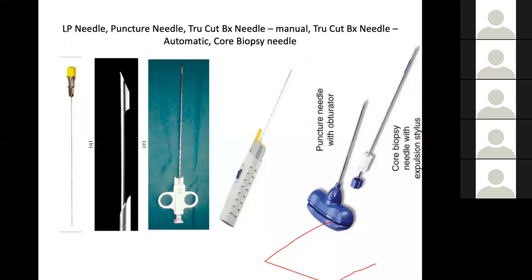These are thin needles. The usual needles that we use are 22 gauge or 23 gauge. In the pediatric population, even a 27 gauge LP needle is used. But in radiology, when we use a lumbar puncture needle to access small fine collections or to deliver agents such as alcohol, we usually use a 21 to a 23 gauge. Usually it's a 22 gauge.